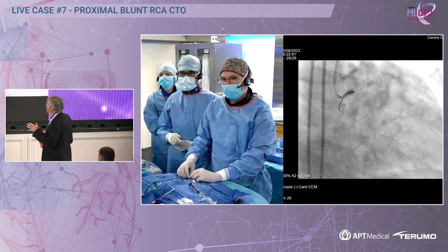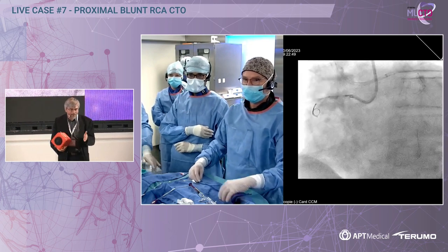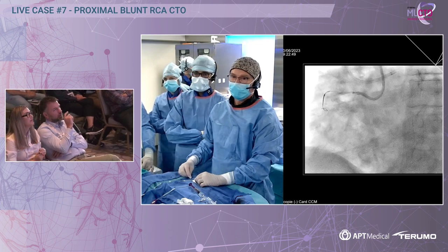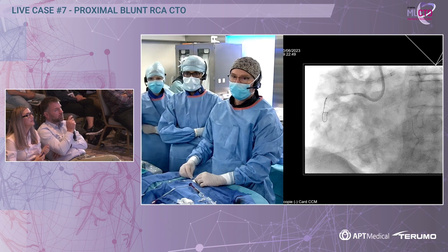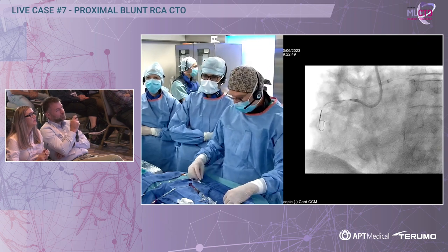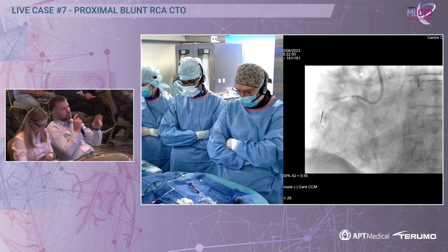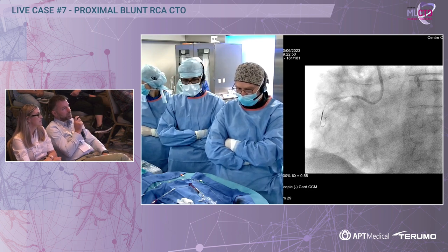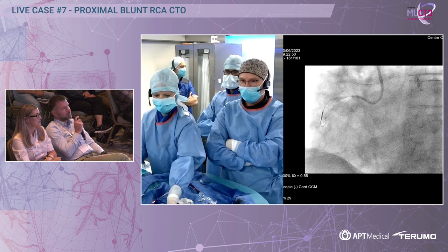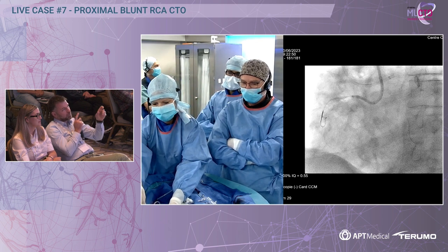We fully trust your experience, Alexander, and we have a question from Aurel Thomas: is this the first curve you did with Gladius and followed with microcatheter? Do you think it will be a little bit dangerous after to stent that? And the second question: when you make a knuckle, isn't it better to navigate with the Ultimate instead of Gaia? Because with a big loop, I don't know if you have good control of Gaia in that big space.